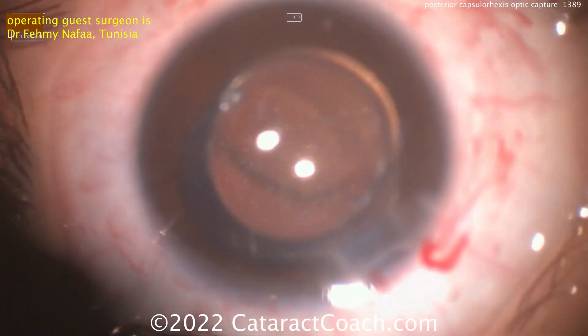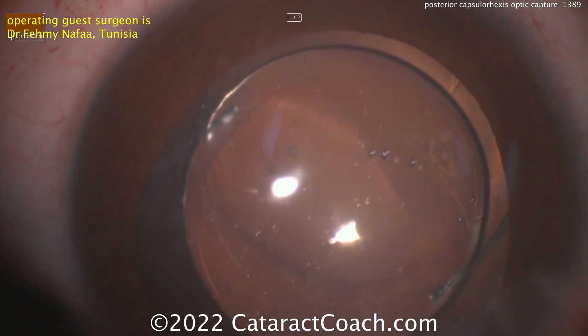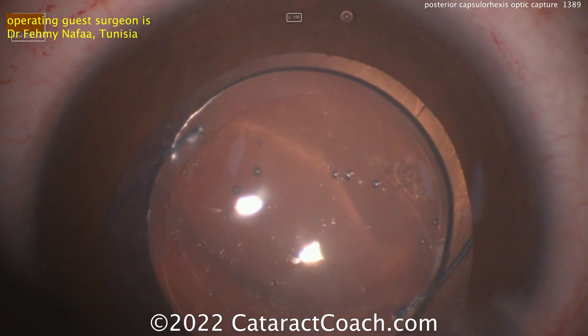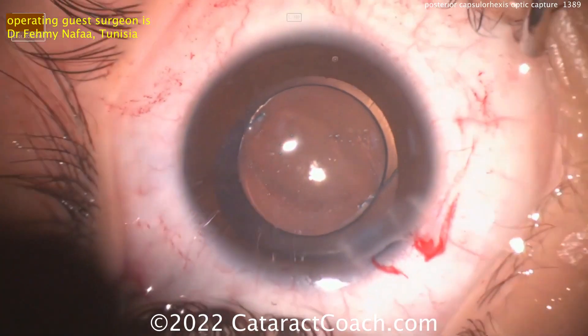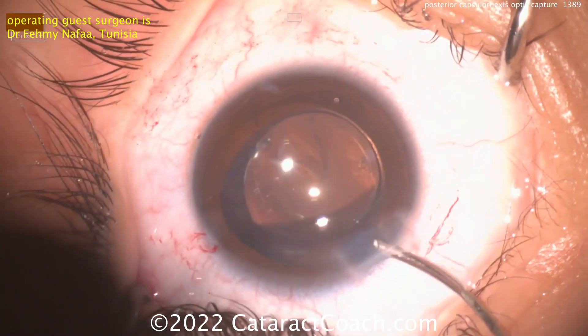You need a rexis of about four and a half to five millimeters — five is ideal. If you have a baby-sized rexis, it's going to be tougher. Now look at the red reflex — you can see exactly that the optic is very secure now behind the posterior capsulorexis.